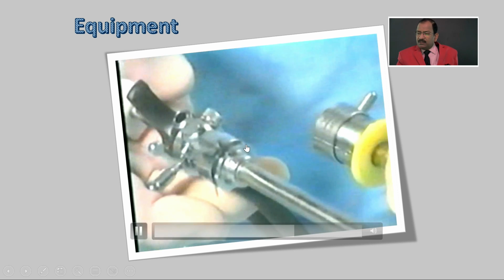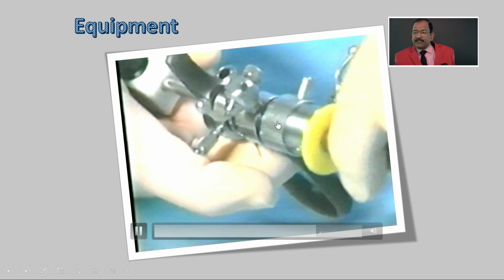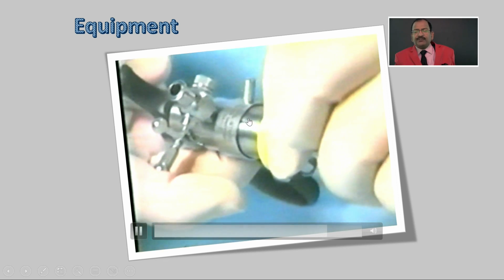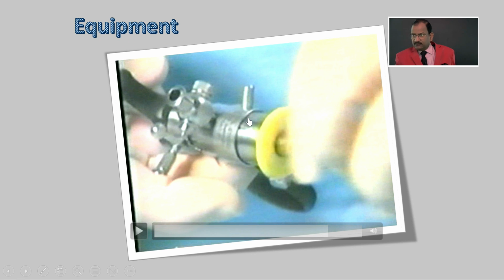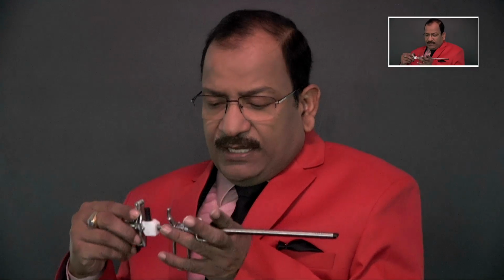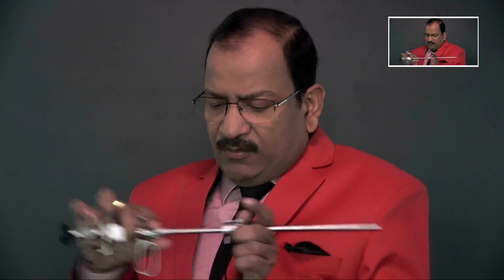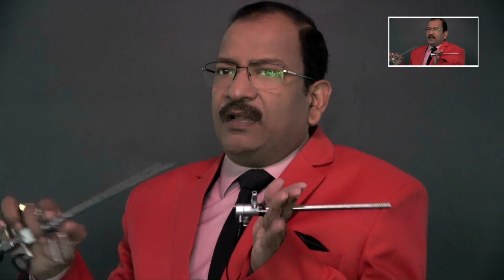So, this is now the outer sheath. And the outer sheath, as I told you, what is the function of this? First is suction, meaning fluid exit. Another function is it acts as a cannula. What do I mean, it acts as a cannula? I will tell you. Once you have started a section, and suppose due to any reason you have to remove it, then you are not supposed to remove everything. What you do, open it and remove this only. Never remove the outer sheath and change the working element.